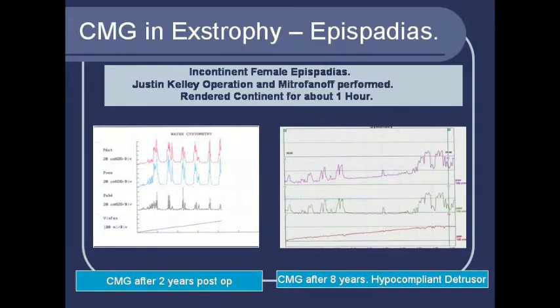And we did a CMG that showed the detrusor pressure continuously rising. So she has changed from a reasonably good detrusor to a high pressure situation, and we put her on oxybutynin now. She has not come again. This is a recent case. So this is what I say, that any man-made obstruction to the bladder can react very unfavorably given time.